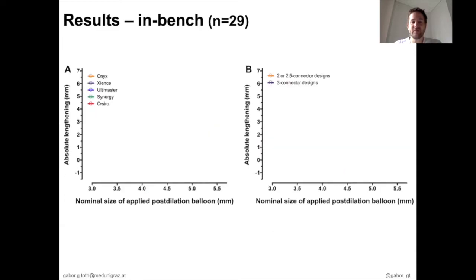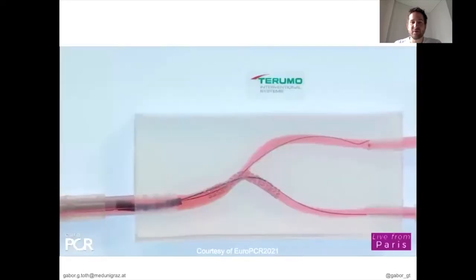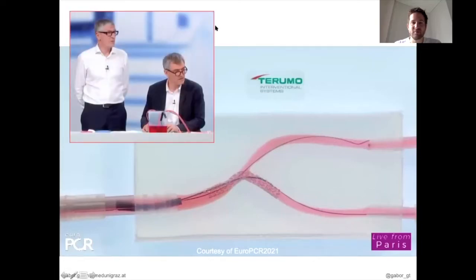Comparing different stent brands, we haven't seen any difference, neither when we compared 2 versus 3 connector designs. Confirming our findings, the best demonstration I have ever seen with proximal stent lengthening was done during a bench case performed by 2 of the greatest bifurcation operators during EuroPCR this year.